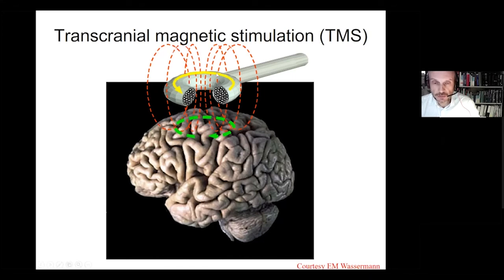This has replaced the direct electric stimulation, and I remember a Japanese fellow who had worked with me in the United States who still had suffered electric impulses, which of course was not a good way to study cortical physiology. And about 35 years ago now, an English team, which included also the former chairman of neurology in Bern, Christian W. Hess, developed this system.